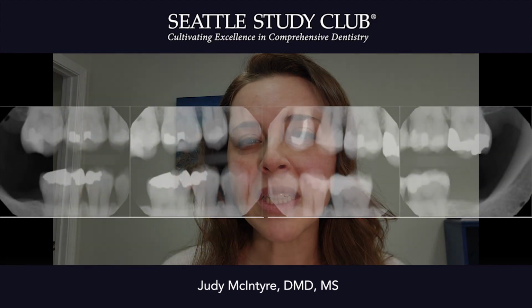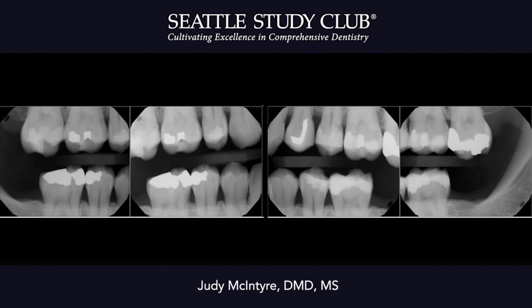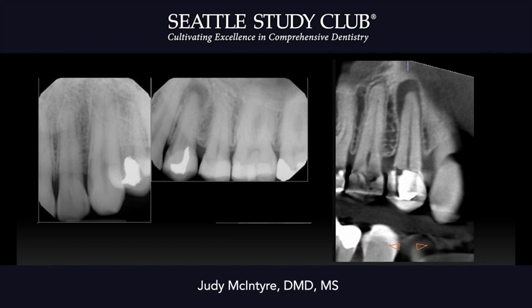In this specific case that I'm sharing with you, you can see that there is a large restoration on this premolar, very close to the pulp. Again, no recent PA. However, when we took the PA, you can clearly see that there's a periapical lucency, as well as the extent of it that becomes so clear on the 3D scan.